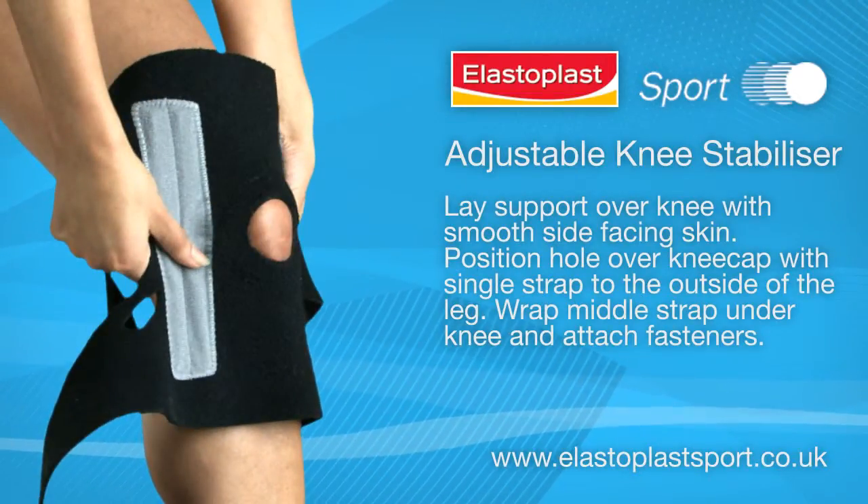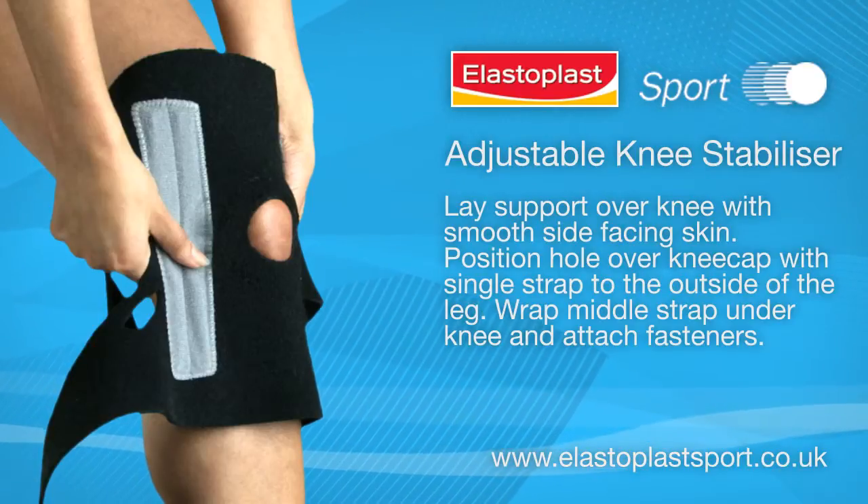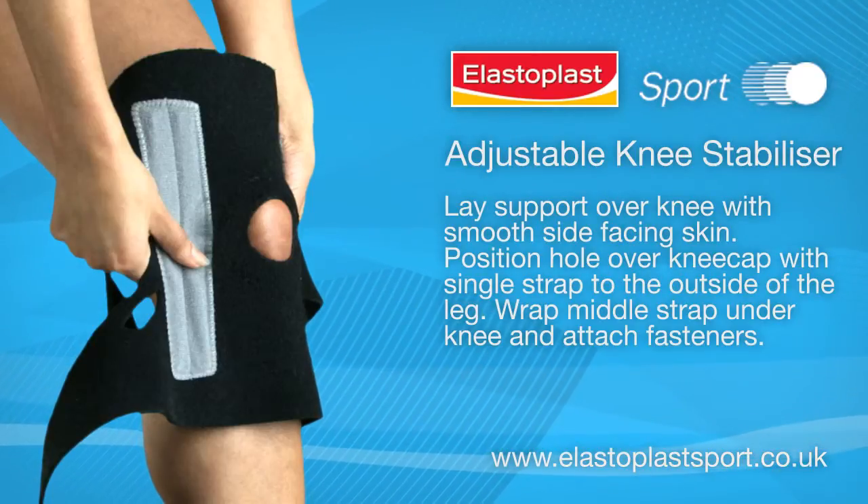Lay the support over the knee with the smooth side facing the skin. Position the hole over the kneecap with the single strap to the outside of the leg.